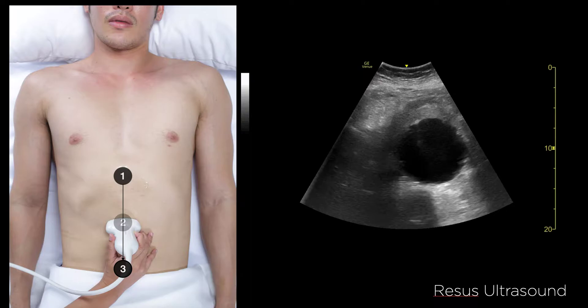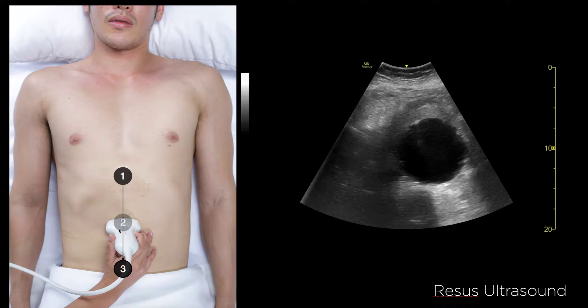You need three points of scanning. Start from the epigastrium with the probe in transverse view. Start at the epigastrium, which is the proximal aorta, then move the probe down a little. At the mid-aorta, bowel may obscure the view — don't worry too much, just move the probe down toward the umbilicus where you will normally see the aorta again.